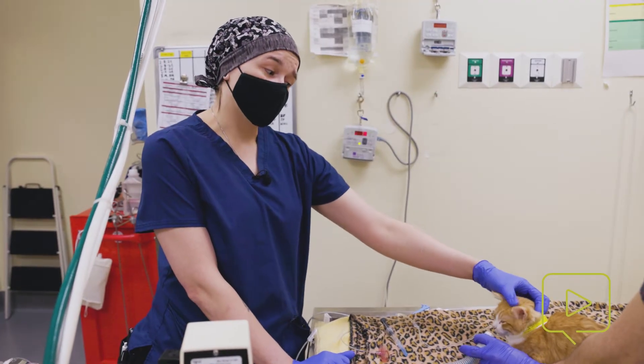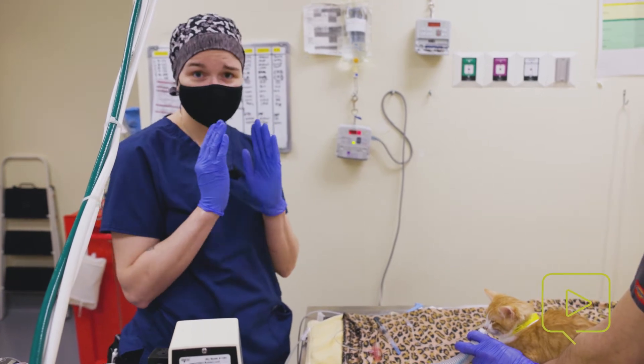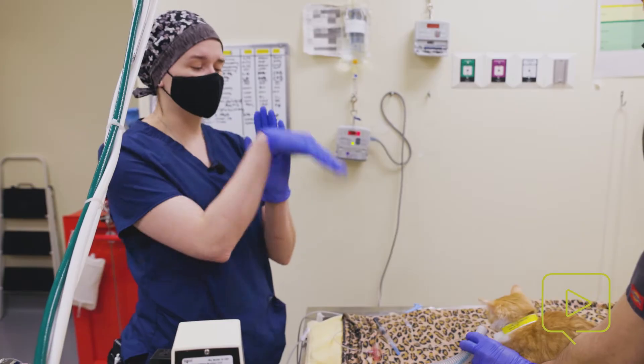Another thing that makes it a little bit difficult in cats is that their laryngeal folds are very sensitive. They do a lot of fluttering, which can make it difficult to pass the ET tube in.